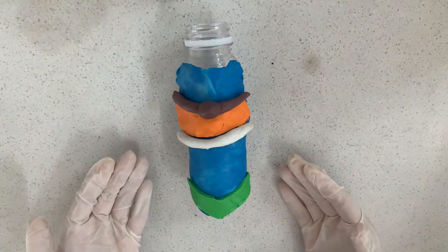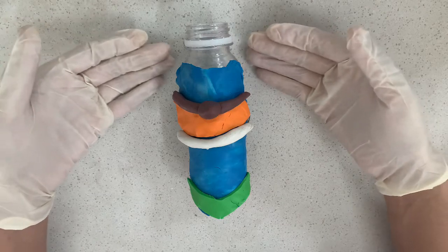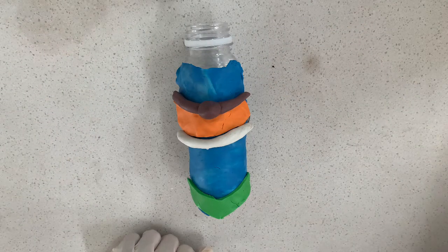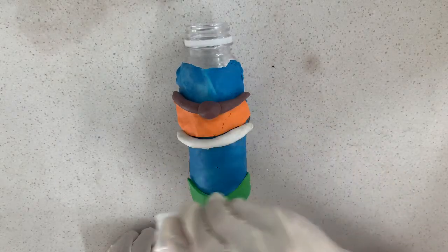Place the patient in a supine position with neck extended by a pillow or bag placed under the shoulders to deliver the trachea out of the thorax and to give adequate access to the cervical trachea. Sterilize the skin of the anterior neck and chest and drape the neck.